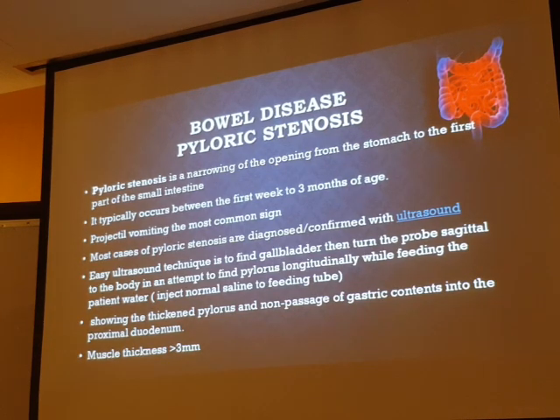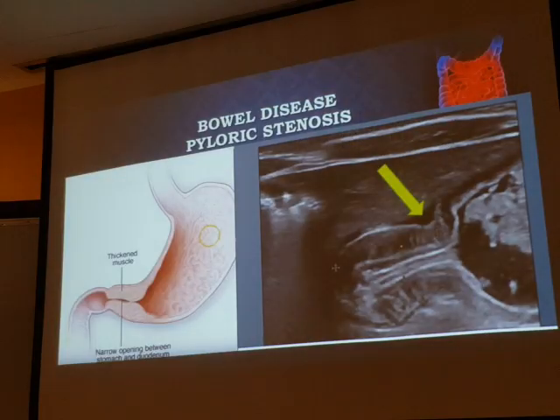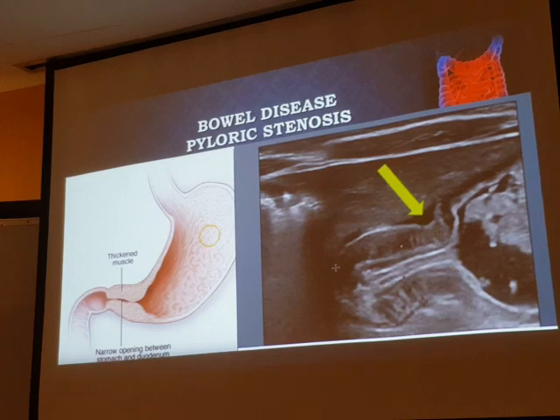Of course, for the feeding you have to have an assistant nurse or the mother of the baby to feed. She will start feeding and you will start scanning and observing. Sometimes we have an option to save as a video, if the doctor will not attend the exam with you. I hope it's clear.